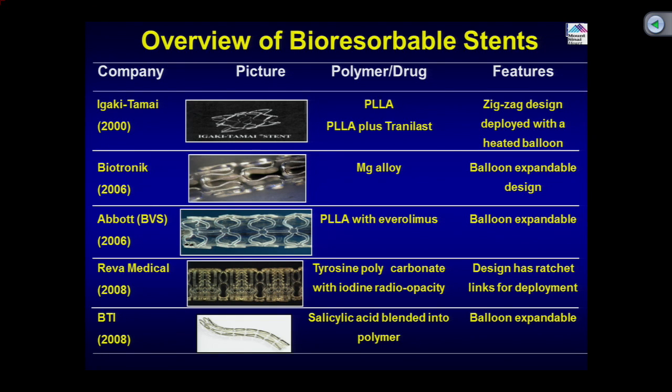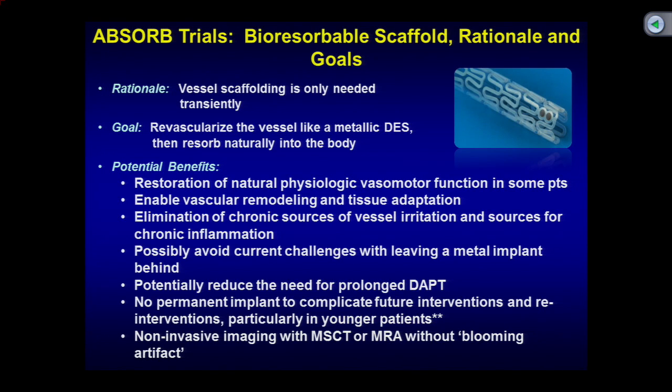There are a lot of companies involved in making these bioresorbable stents. The one which has come to fruition in trials has been the Absorb, which started with the registry and then the randomized trial, but the concept remains the same: you take care of the acute problem, and the foreign material disappears after a few years.